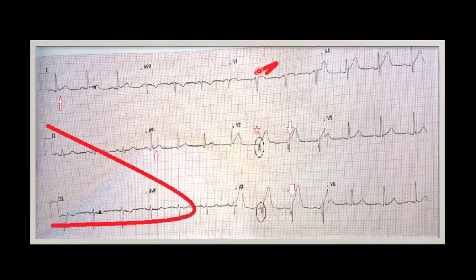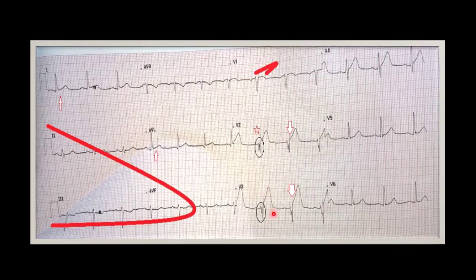The first big thing is that there is very poor R wave progression. If you look at V1 carefully, you will notice that this ST segment elevation is concave. This is what we call a fragmented QRS complex, which indicates myocardial scar. These are tall T waves that are broad-based. This indicates an anteroseptal myocardial infarction.